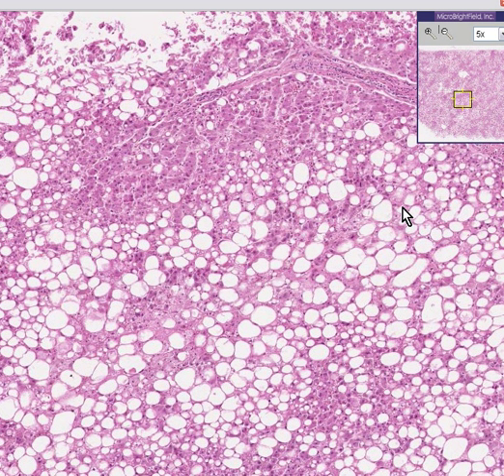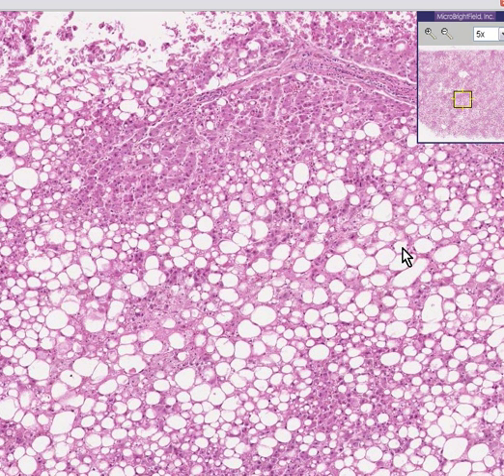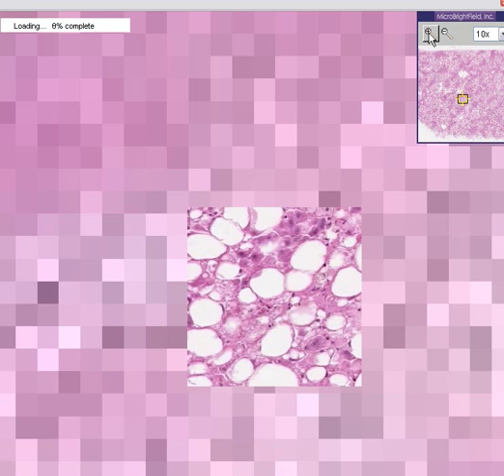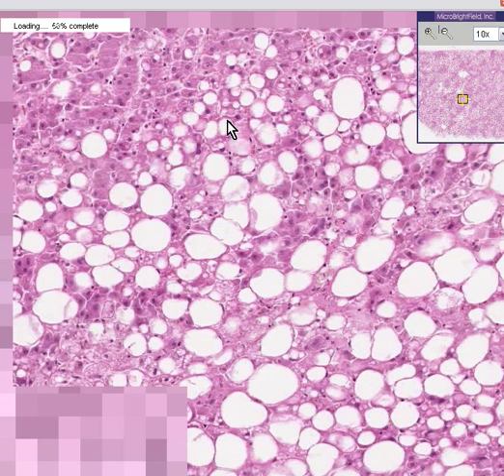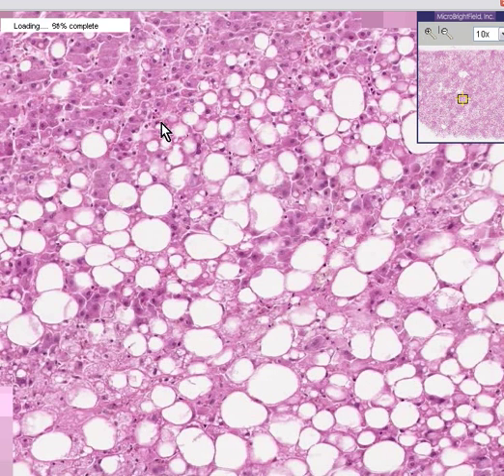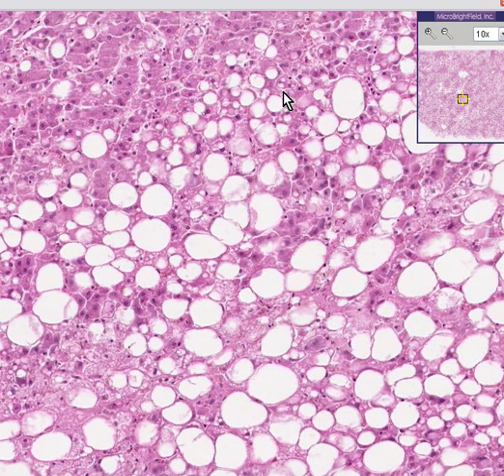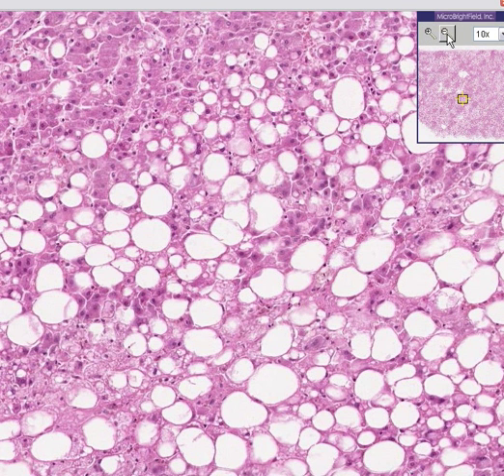Also notice that if you wanted to divide fatty liver or fatty change or fatty metamorphosis into two different types, these large vacuoles are macro. These smaller ones in here, which look to be within hepatocytes, these small tiny things are microvesicles.